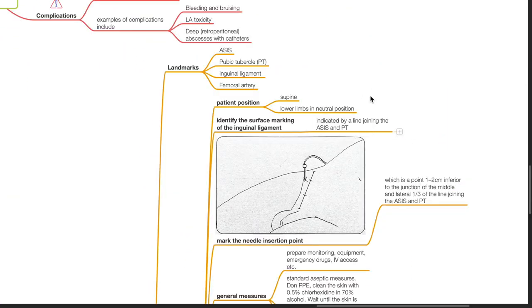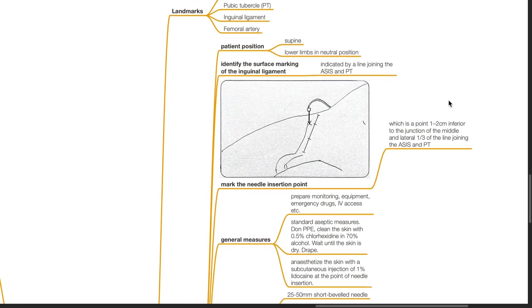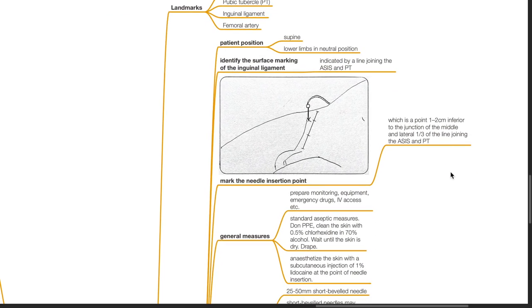Landmark technique. Important landmarks include the ASIS, pubic tubercle, inguinal ligament, and femoral artery. The patient is positioned supine, with lower limbs in neutral position. Identify the surface marking of the inguinal ligament, indicated by a line joining the ASIS and the pubic tubercle. Mark the needle insertion point, which is a point 1 to 2 cm inferior to the junction of the middle and lateral thirds of the line joining the ASIS and the pubic tubercle.